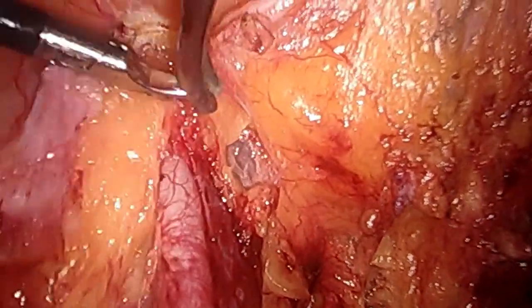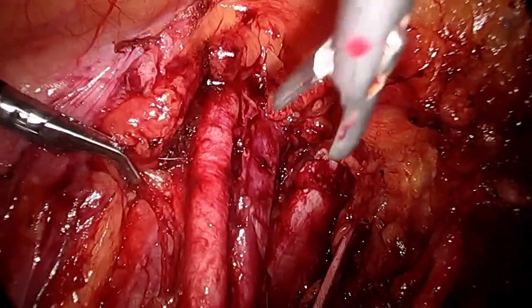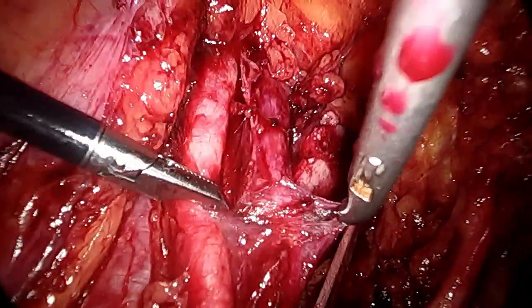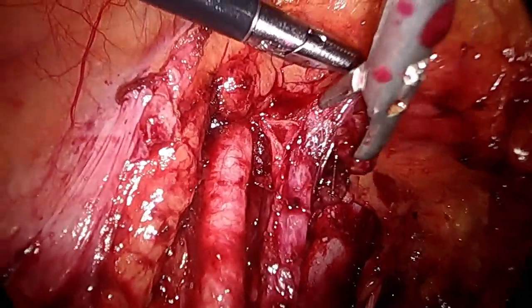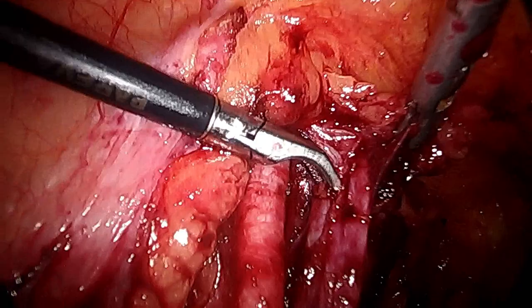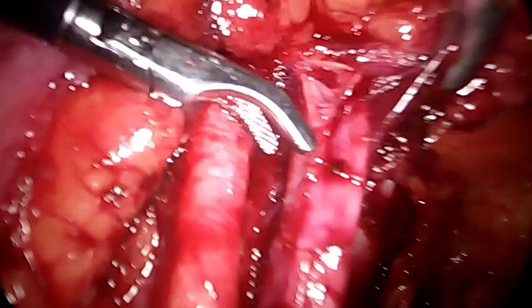The first and foremost thing is to dissect the area around the rent. Injury to the external iliac vein can happen during complicated cases of endometriosis where fibrosis is totally adherent to the vein, and because the vein is relatively fragile there are chances when pulling or dissecting adhesions that the vein might get injured. Secondly, it can be injured when doing a radical hysterectomy where lymph nodes are enlarged and adherent to the venous structure.